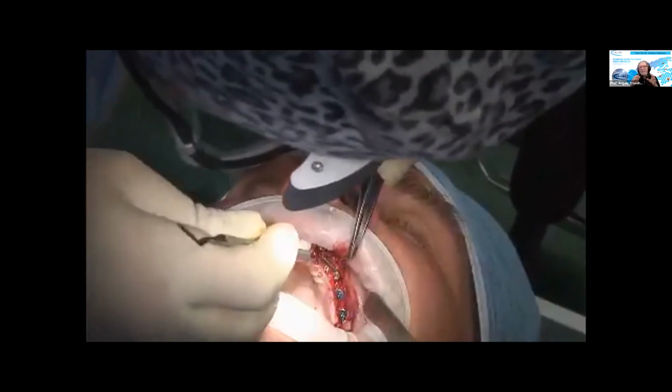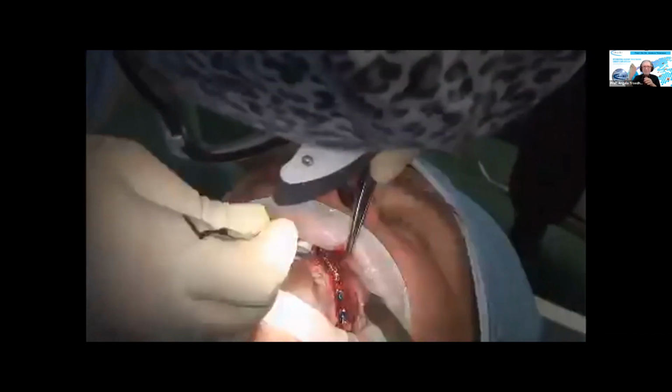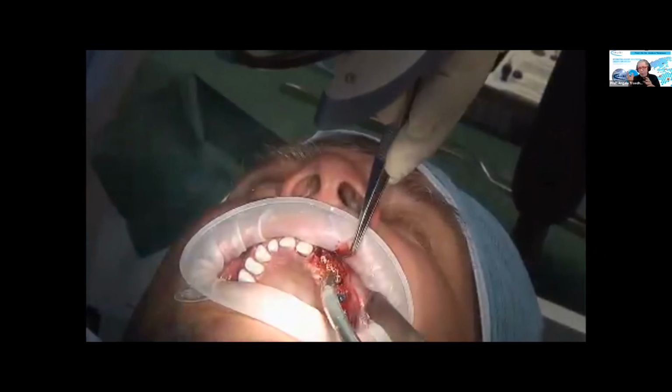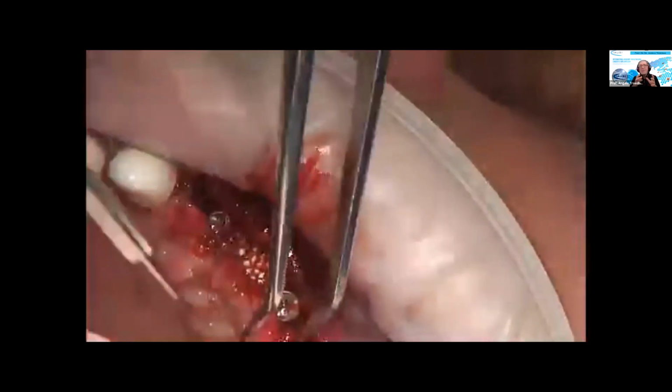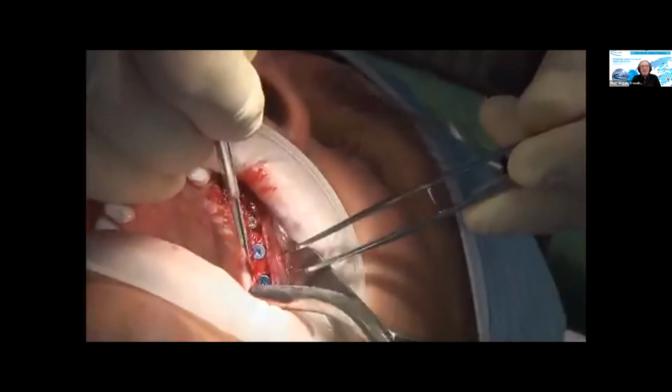We made another study, and this was published multiple times. You can read it up in our Academy's channel, where you can download all the relevant information. It's really the first replacement of autologous bone blocks. And of course, in this case, it gives additional primary stability to the implants. So now the cover screws are attached.